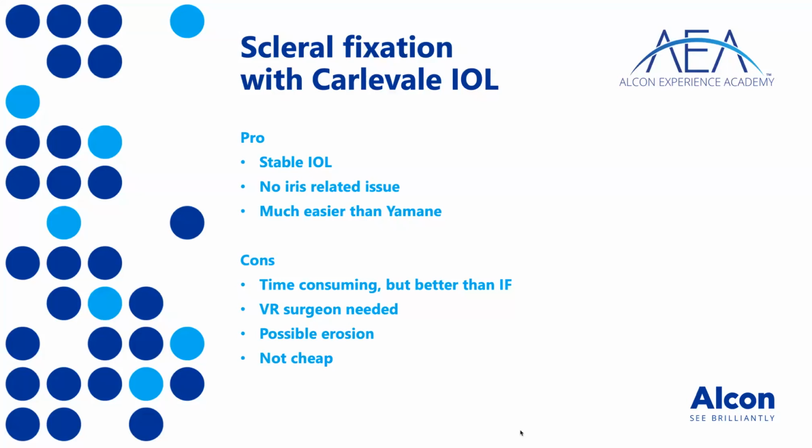It's definitely way more expensive than a standard 3 pieces IOL. So this may or may not be an issue for you based on the hospital where you work, but indeed it's something to be taken into consideration. But kudos to Carlevale, who indeed has invented a beautiful piece of equipment which is making our life much easier.